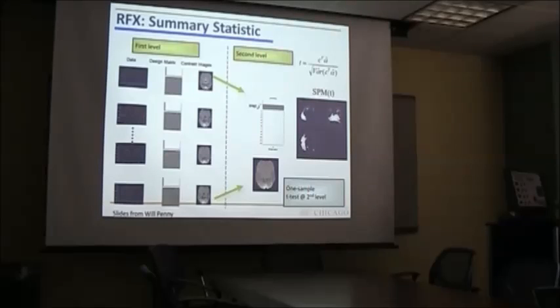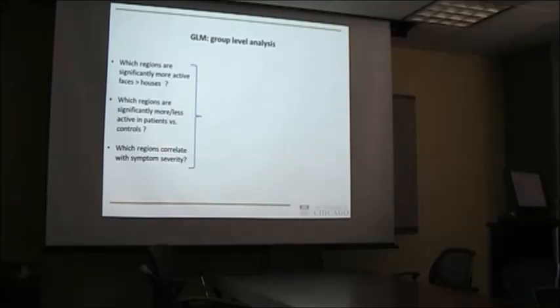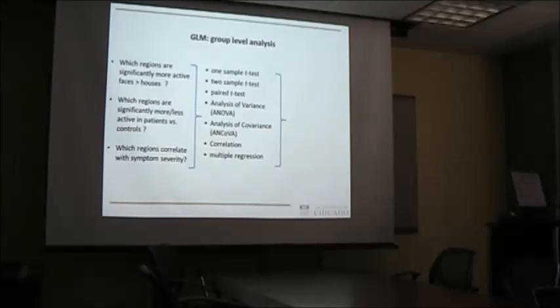And sticking with the example, another thing you could do, for example, you could say, well, in which brain regions do either faces or houses have stronger activations compared to just your circles, something like that, right? That would be another contrast you could set up, etc. Depending on your research question, you have a bunch of different tests that you can do on this group level GLM analysis.